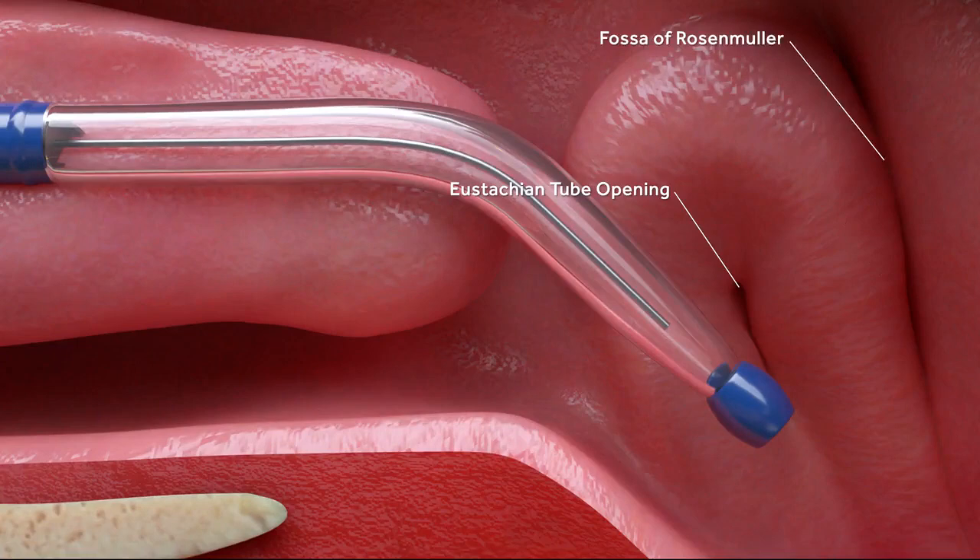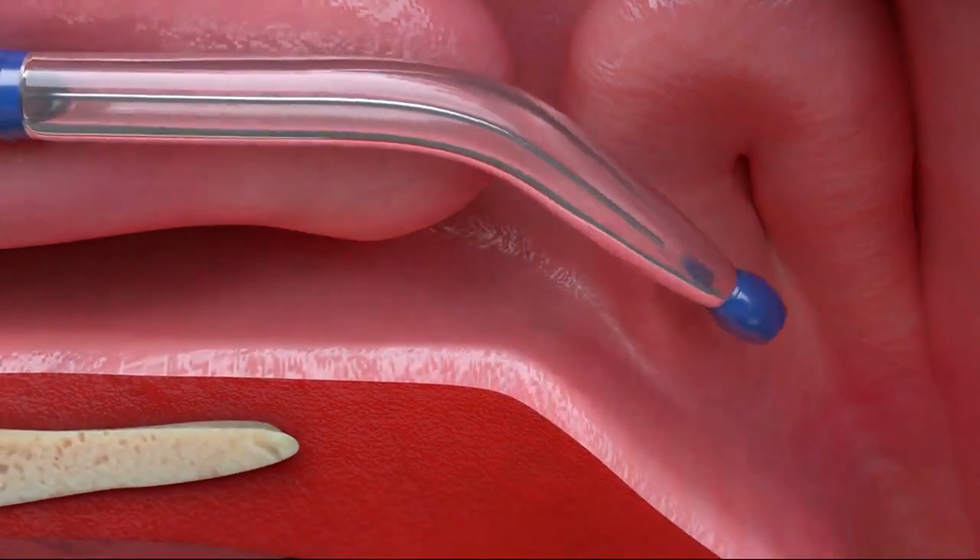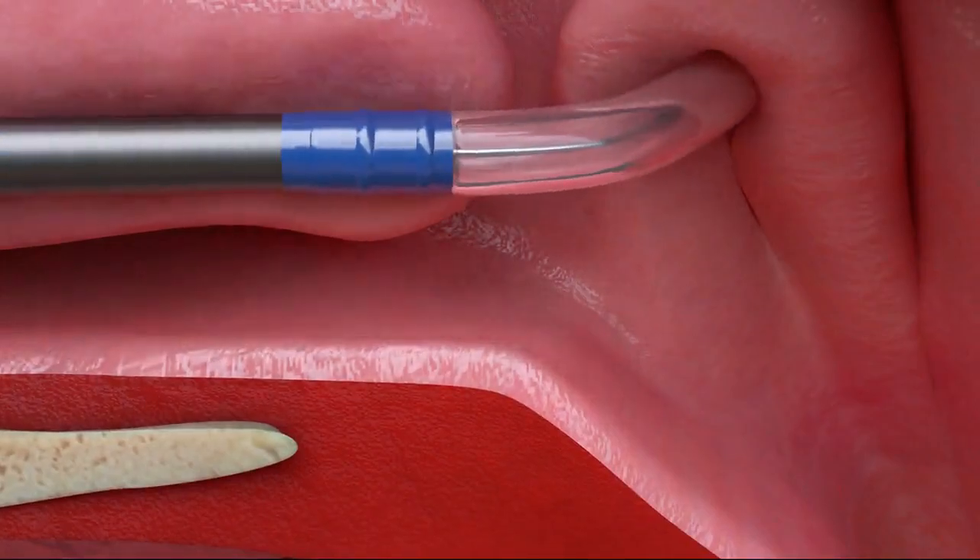Rotate the tip to align the balloon catheter with the trajectory of the eustachian tube, then gently advance the balloon catheter into the eustachian tube.